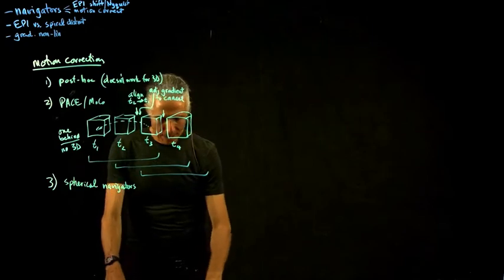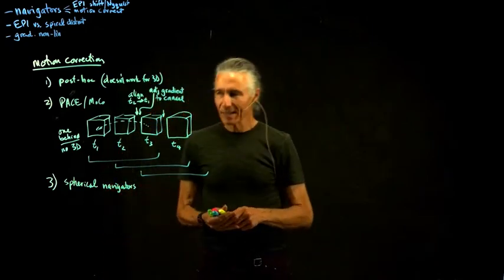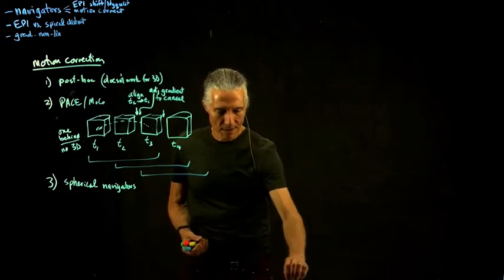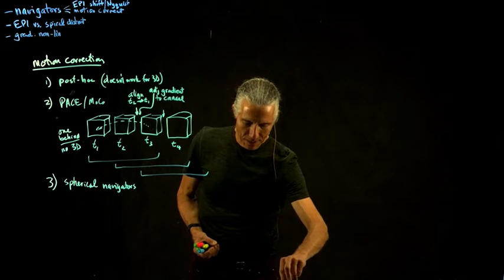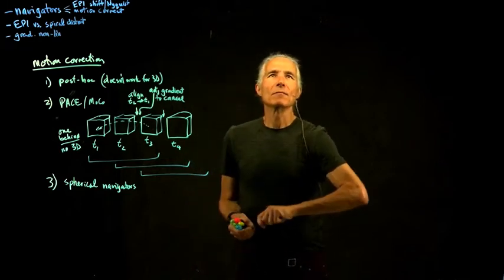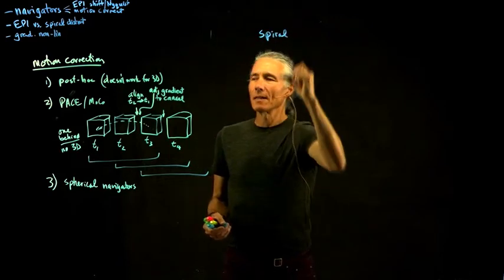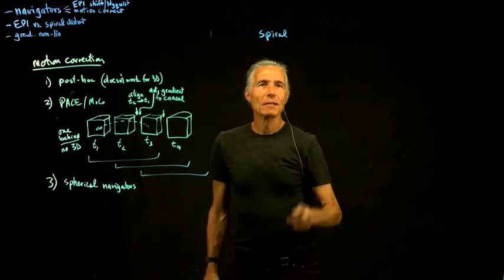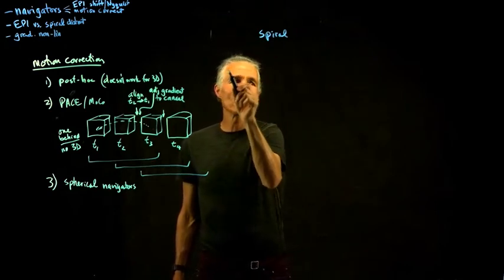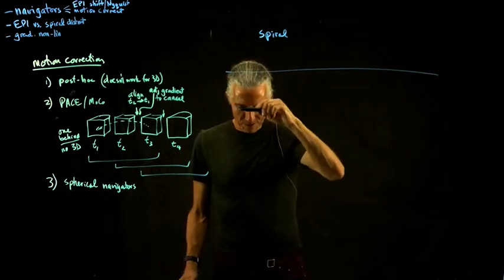basically what they did was something kind of like a spiral. So why that? Because spiral, because you can do it real quick. And so the idea is, before you actually collect your real data, you only have a couple of milliseconds to do this.